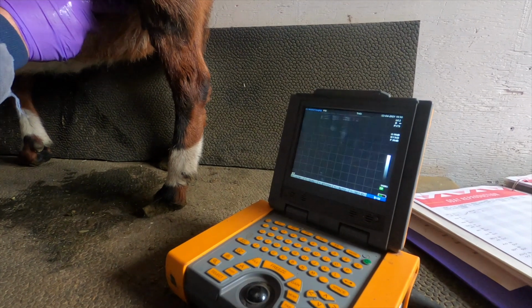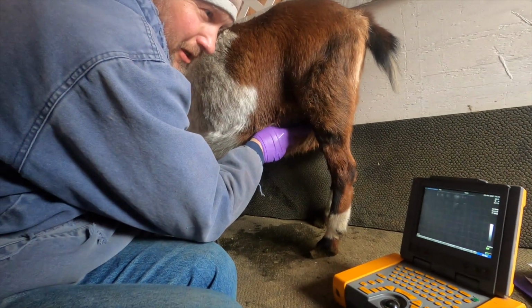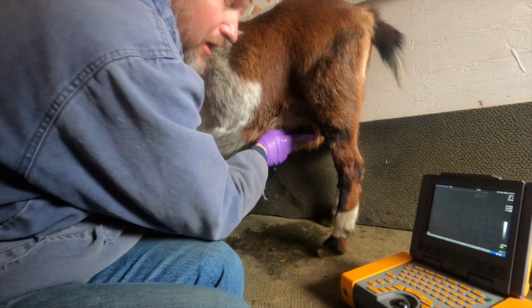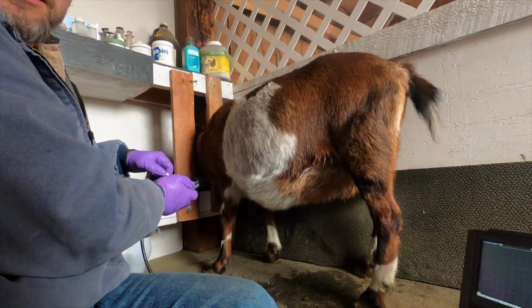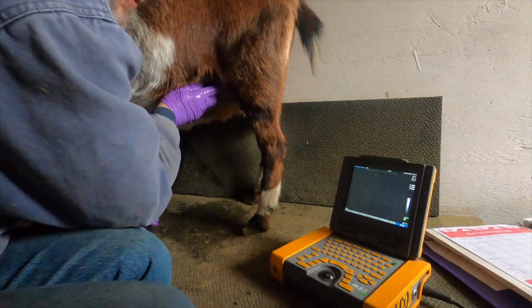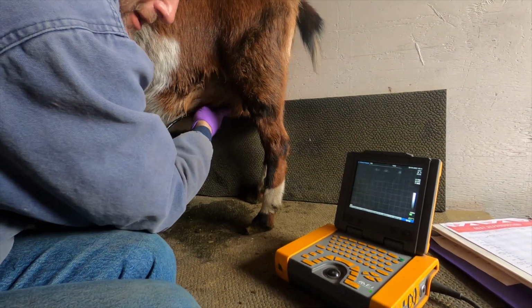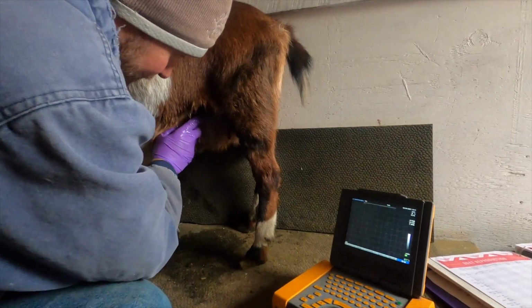Black fluid always shows up black. What I think I just saw were some cotyledons. Cotyledons are the buttons. It's the attachment between the uterus and the amniotic sac. Maybe you should have trimmed up the hair. Well, to do it properly, you're right, we should shave them, but it's cold out, and this next week it's going to be really cold.